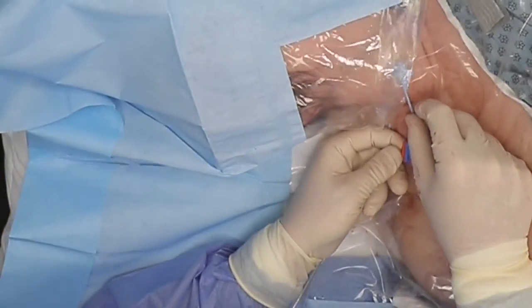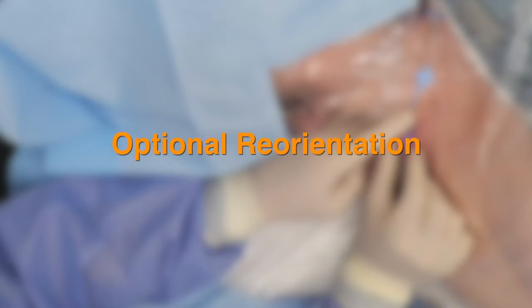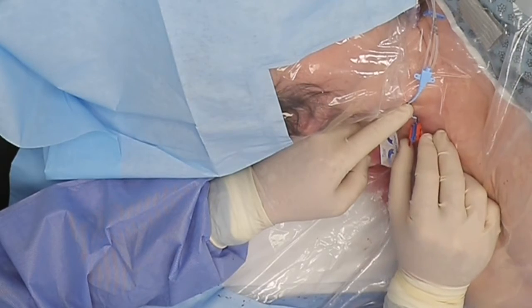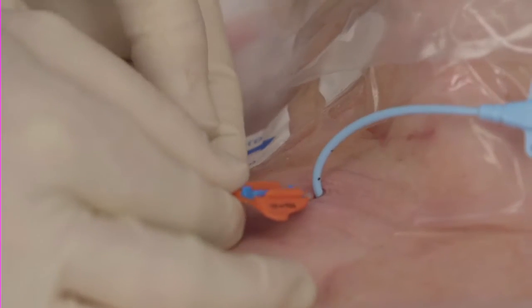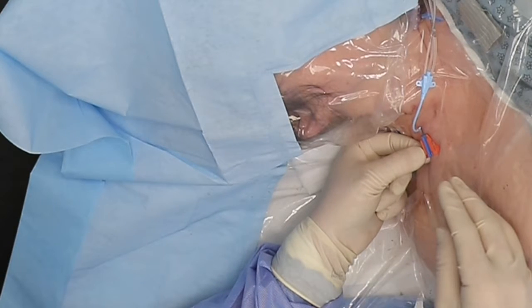Avoid areas of flexion like joints. For optional reorientation: if you wish to change the orientation of the SecuraCath base, fold the wings downward and turn the folded base to the desired orientation. Then release the base to allow the feet to open. Gently retract the base to be sure there is some subcutaneous tissue between the SecuraCath feet and the dermis.